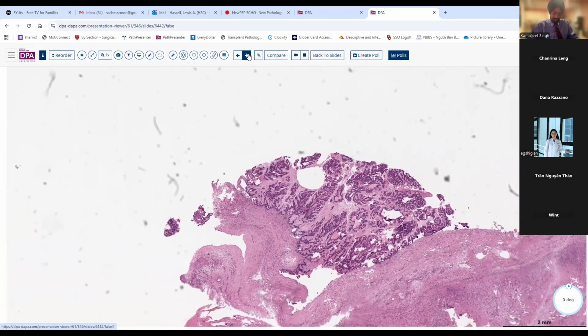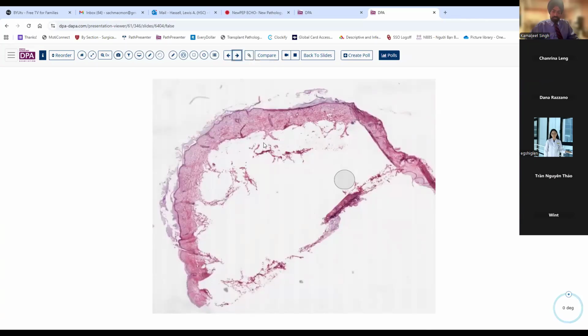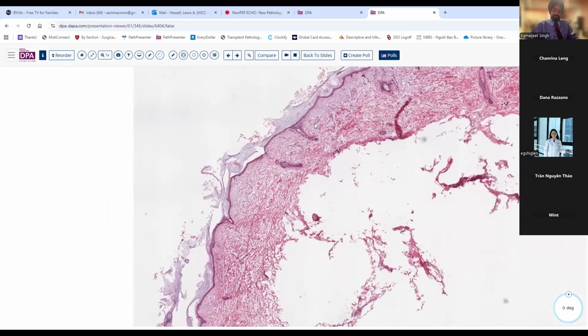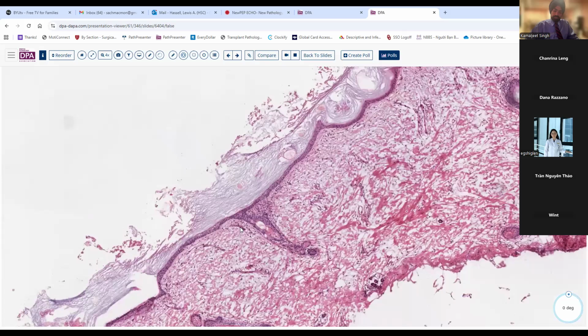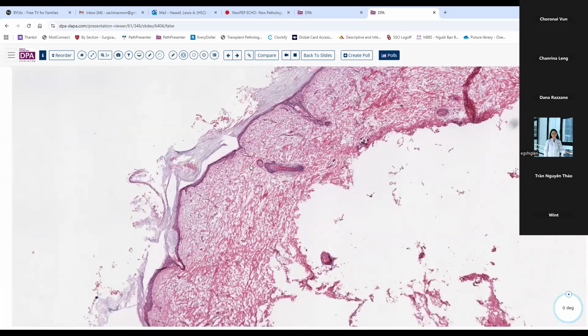I think we have another example of this, or another example of a mixed tumor. Here's a more typical slide that we see, bad frozen section, a lot of stuff that sort of falls apart. But this is a very, very common element. As you see here, we've got a sort of cutaneous appearance. And so you'd know right away that this is at least a teratomatous element.